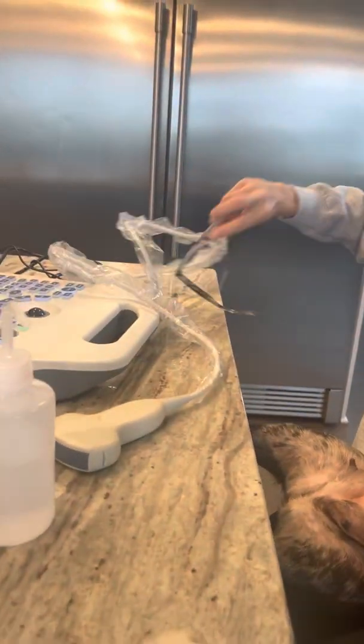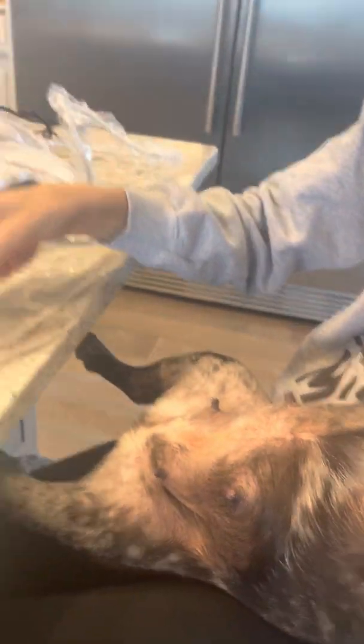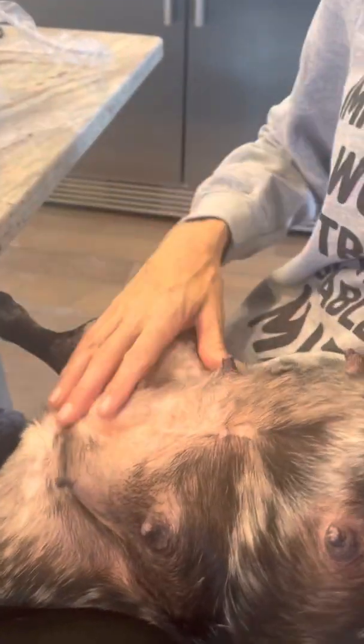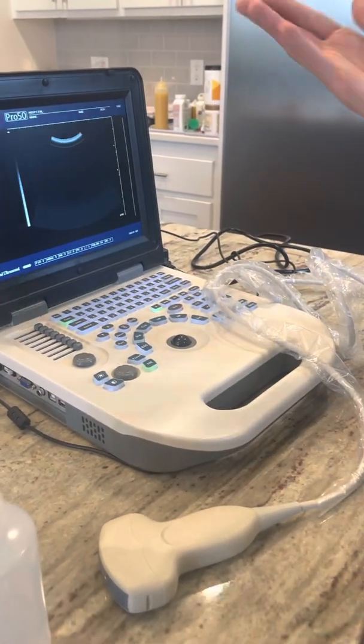I have my wand right here. I like this kind of flat wand — it works well on a dog's belly. You're going to want to check this area right here. The rule of thumb for ultrasounds is if you see a couple on one side, your vet tech will typically double that and give you an estimate. So if they saw two, they'll estimate four.